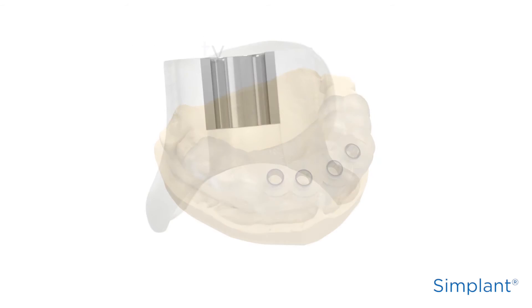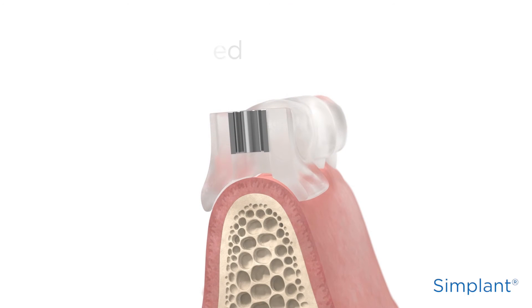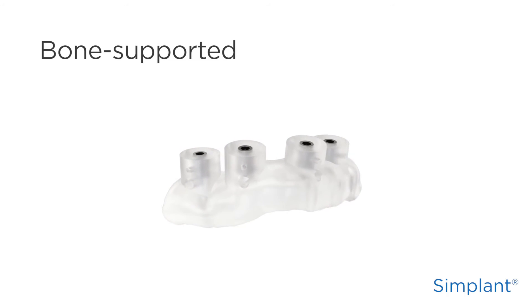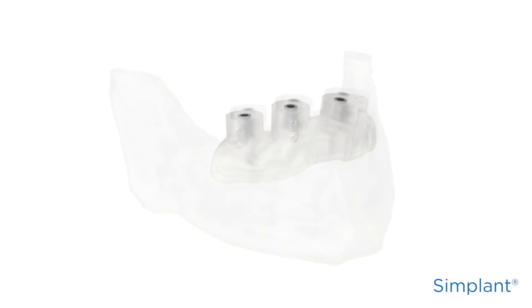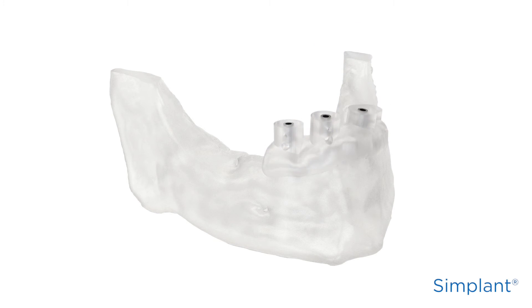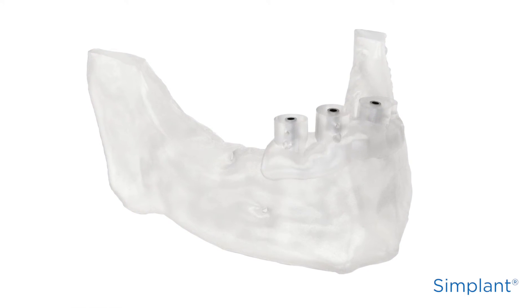For a tooth-supported Simplant Guide, check the position of the guide on the patient's teeth. For a bone-supported Simplant Guide, check the position of the guide on the printed bone model that is delivered with the guide. Check the distance between the Simplant Guide and any remaining teeth, as well as the distance to other important anatomy such as the mental foramen.